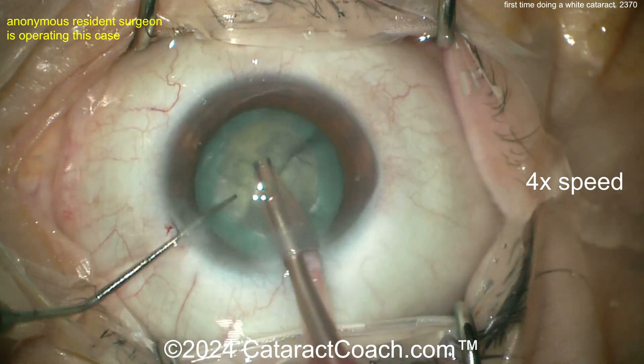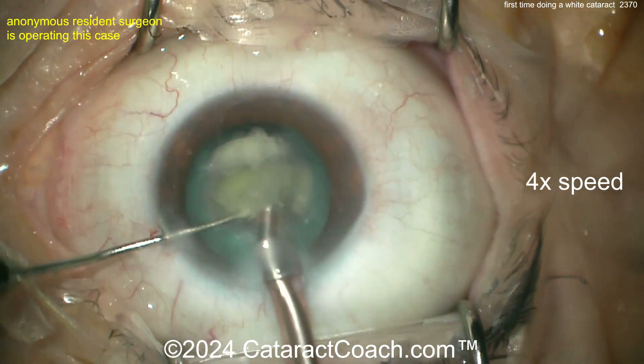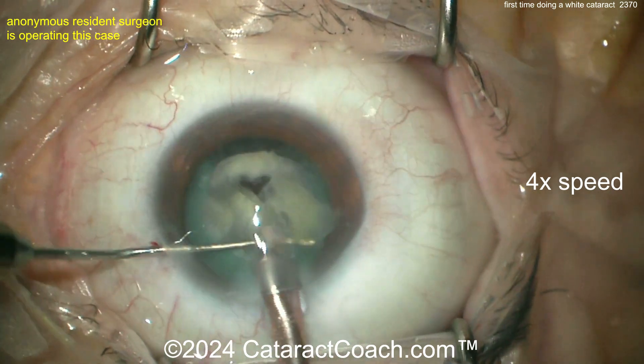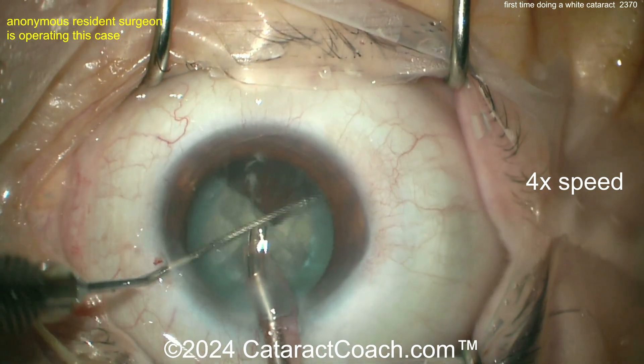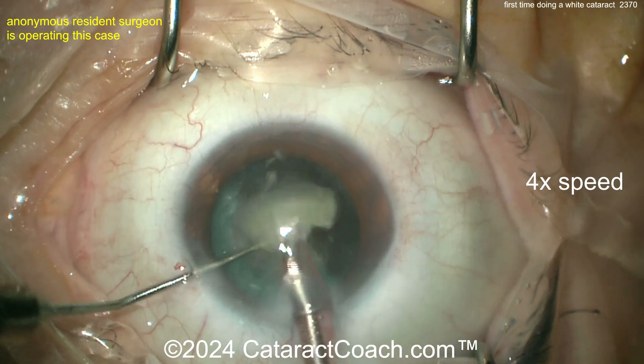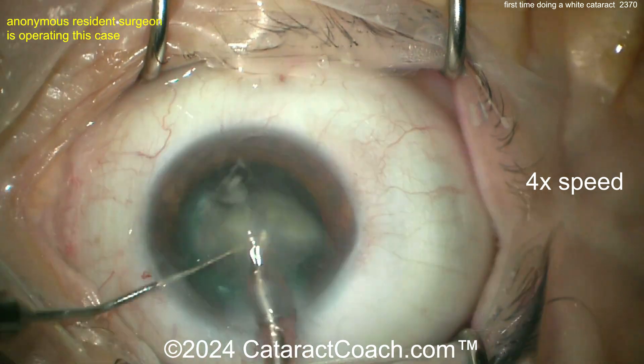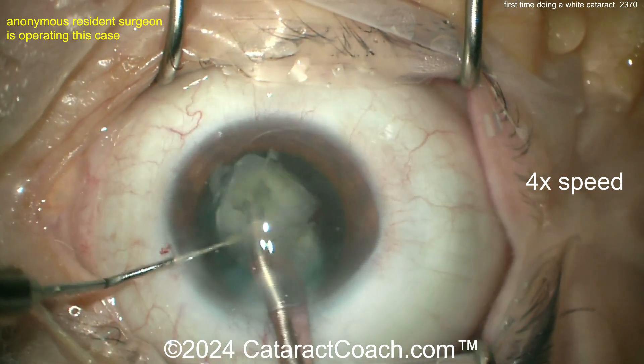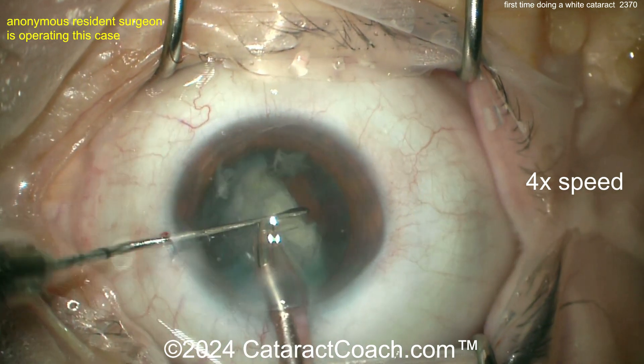Use a much higher vacuum setting on your phaco machine. Once that first piece is out it's much easier because now you have so much more room — the other pieces come out a lot easier. The first piece is the toughest to get out of the bag. Again, beautifully done here, eye staying pretty much in primary.